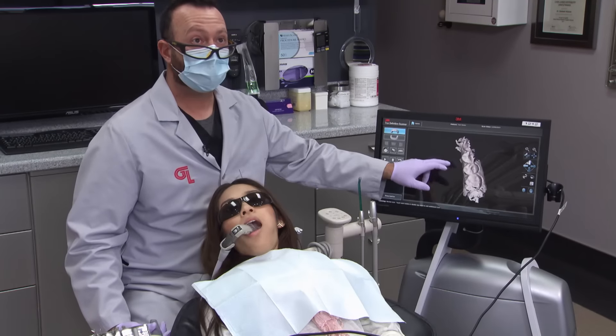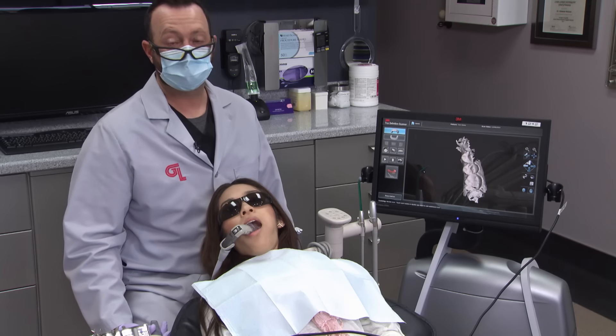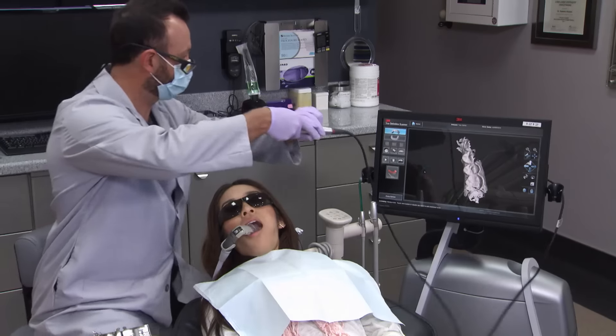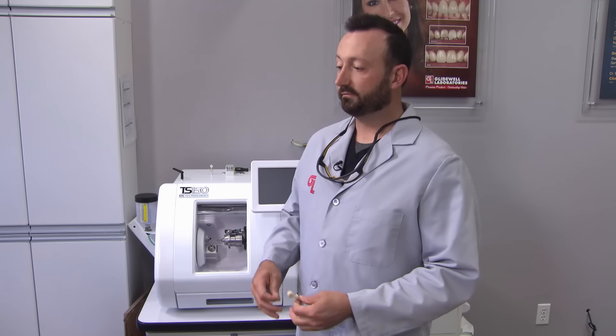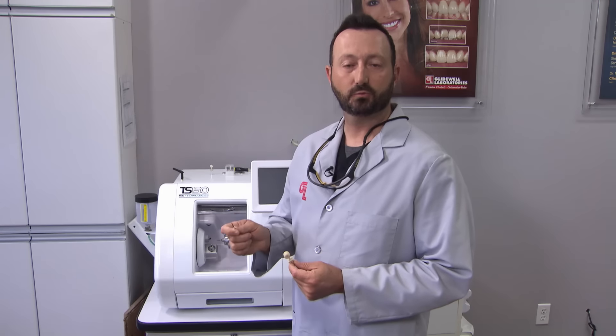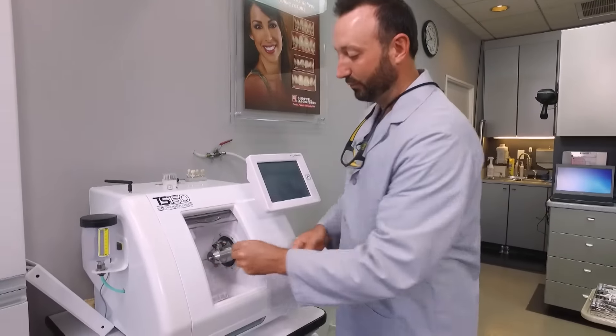After scanning the teeth you're milling today, make sure you scan the opposing arch as well as your bite. Send that over to be processed, designed, and eventually milled. The great thing about the Bruxer Now technology milled in the TS-150 milling unit is that it follows the principle of keeping it simple. Unlike other chairside milling units, the Bruxer Now utilizes one single size block in different shades with one burr — the burr comes with your block. Place it in after your design and start your mill. After milling is complete, simply remove from the TS-150, get ready to remove from the sprue, polish, and get your crown ready for placement on the patient.